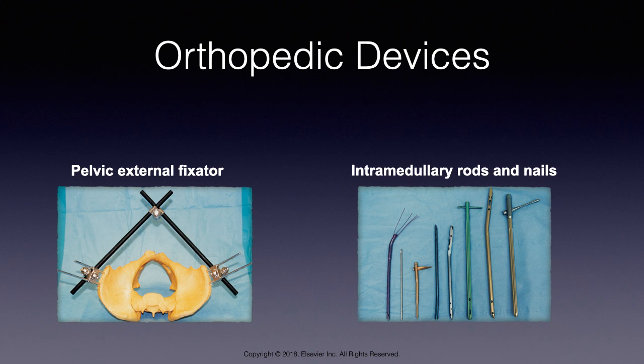On this slide, on the left, you have a pelvic external fixator. And on the right, you have a variety of intramedullary rods and nails.